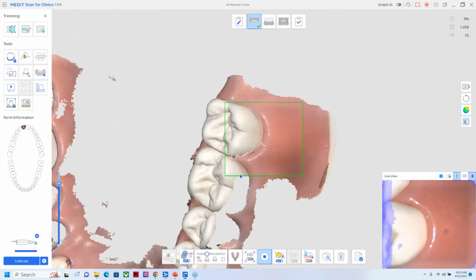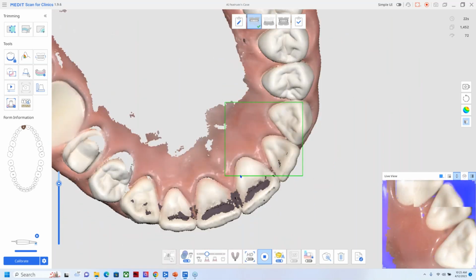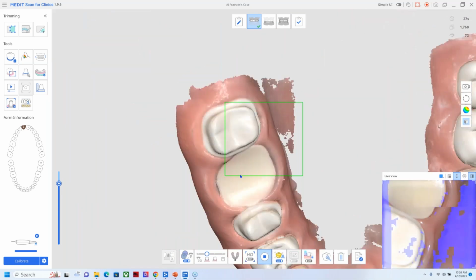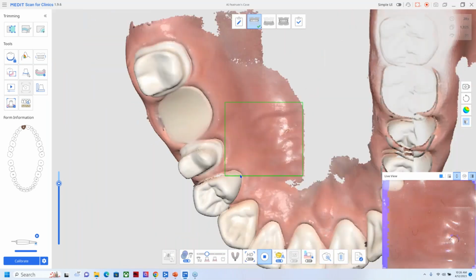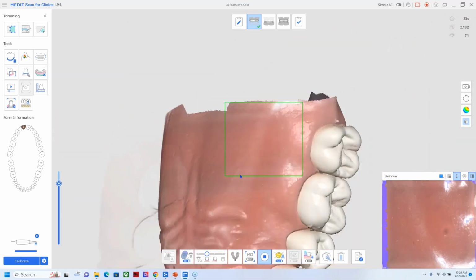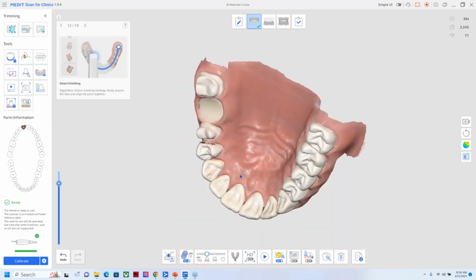Rotate up and over here. And we're not looking for a real perfect scan right now because we're going to utilize the scan to understand some more of the AI features. And I do have to apologize in advance right now. Sometimes while utilizing the webinar platform, it can actually make the scan appear glitchy when in reality it is not.